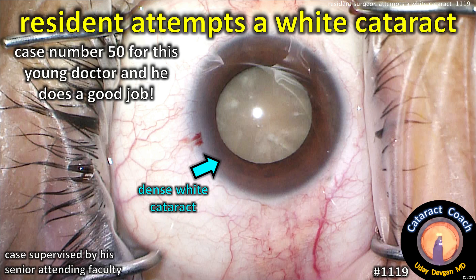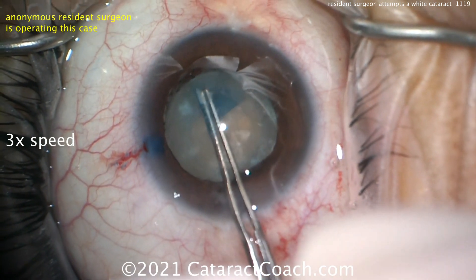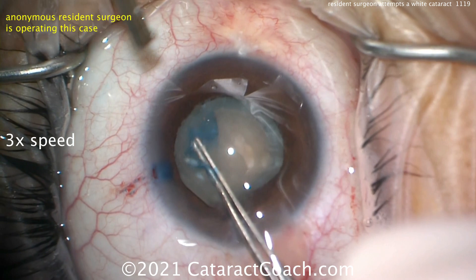CataractCoach.com: a resident attempts a white cataract — this is case number 50 for this young doctor, and he does a good job. The case is supervised by his attending professor. I didn't supervise the case; the video was sent in afterwards, so I like these kinds of cases because you can see how other people teach.